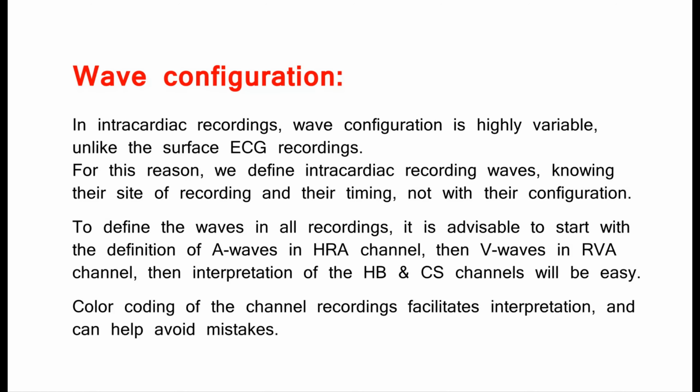Wave configuration. In intracardiac recordings, wave configuration is highly variable, unlike the surface ECG recordings. For this reason, we define intracardiac recording waves, knowing their site of recording and their timing, not with their configuration.